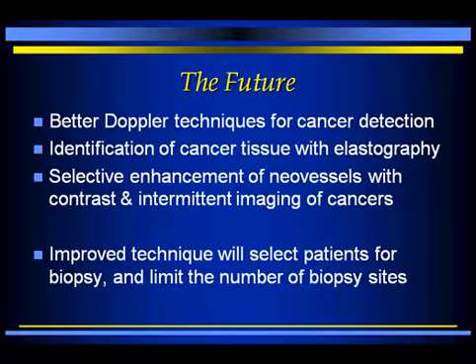In summary, prostate imaging is done for a couple of benign reasons: infertility and inflammatory processes. When you're looking at infertility, you're trying to see, is there an obstruction of the ejaculatory ducts? Is there an absent vas deferens or seminal vesicle? When you're looking for inflammatory lesions, you want to make sure there's no abscess sitting in the prostate. And then when you're looking for tumor, you're trying to direct your biopsies into the area that's going to maximize the positive biopsy yield.